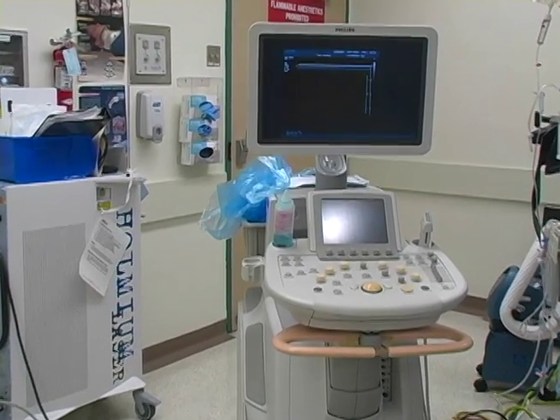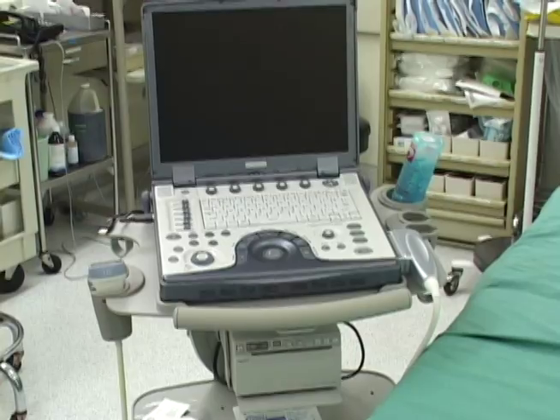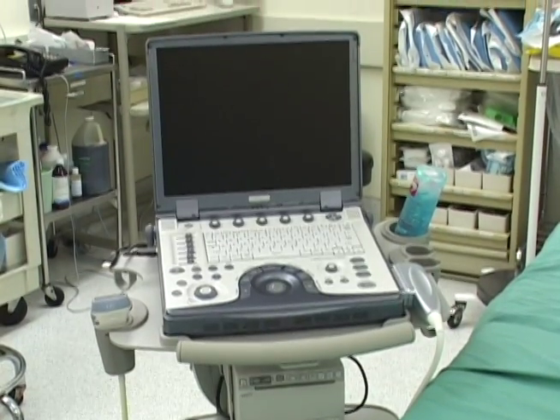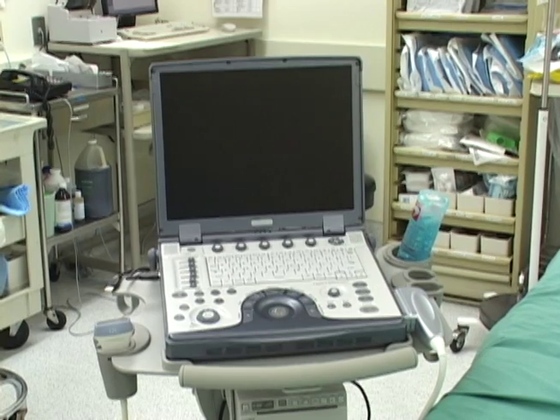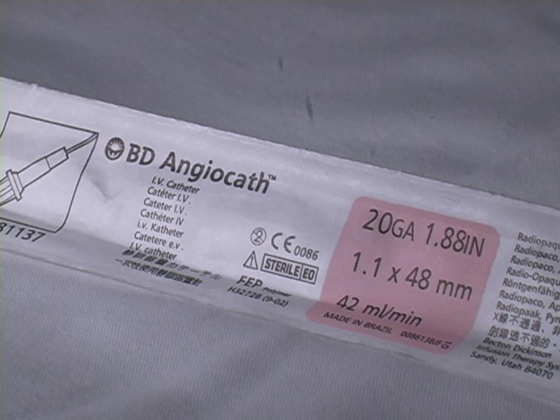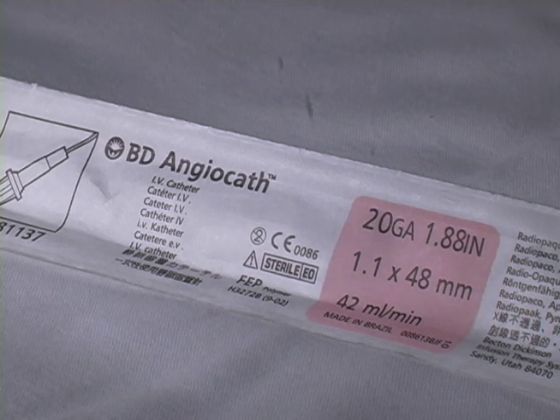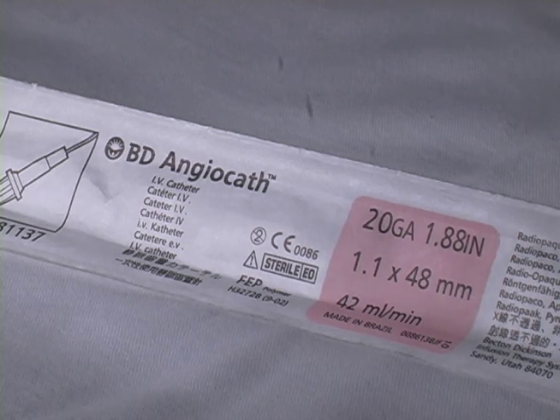Ultrasound equipment comes in many forms, and there is a trend toward battery-operated portable machines. A 20-gauge 1.88-inch BD angiocath is a good choice for the catheter over needle technique.